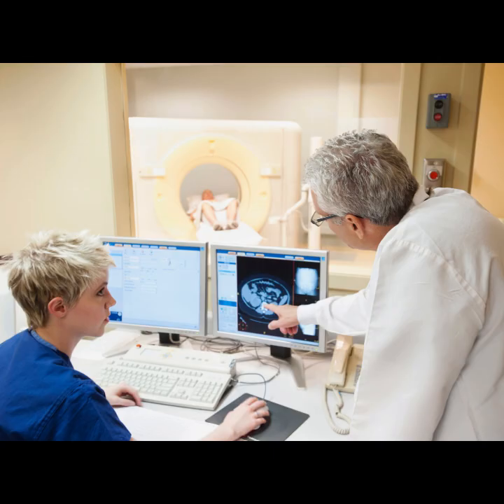It's physically elegant, yes, I grant you that. It is more than elegant. It's robust. It preserves signal intensity for a much longer period, allowing for stable, high-quality multi-shot acquisitions without those severe decay artifacts like ghosting or blurring that you get from asymmetric apodization. This physical mechanism offers a dependable, predictable signal extension that no arbitrary gradient waveform can just replicate on its own. It addresses the R2 problem right at the source.